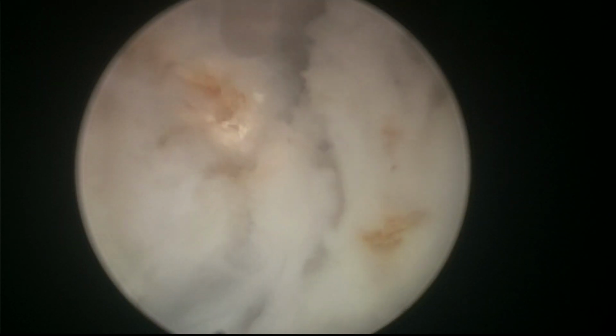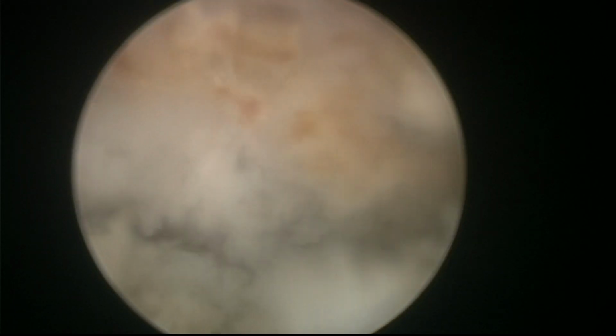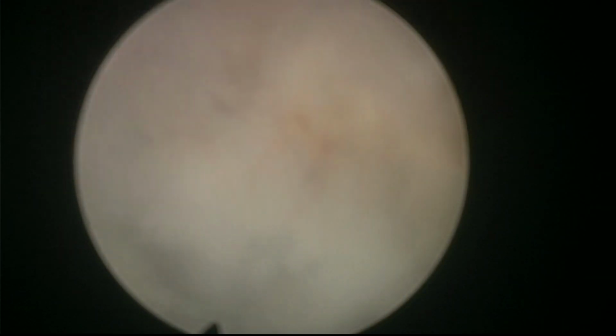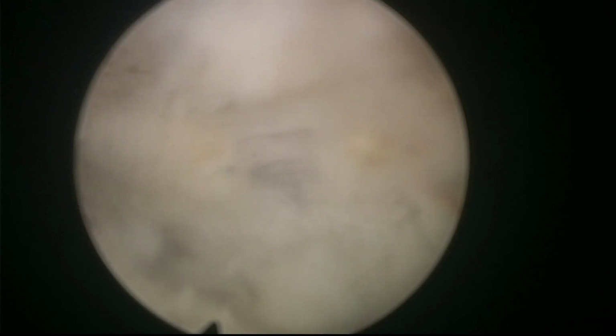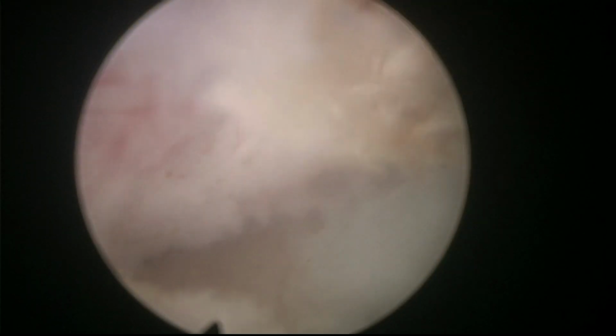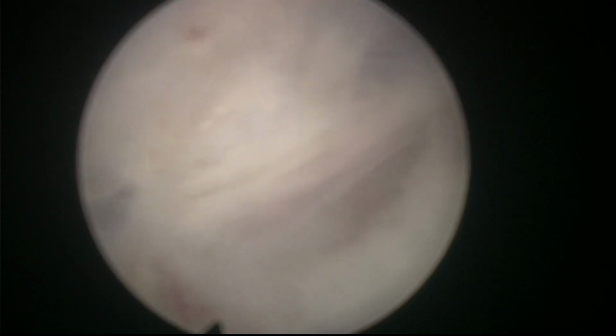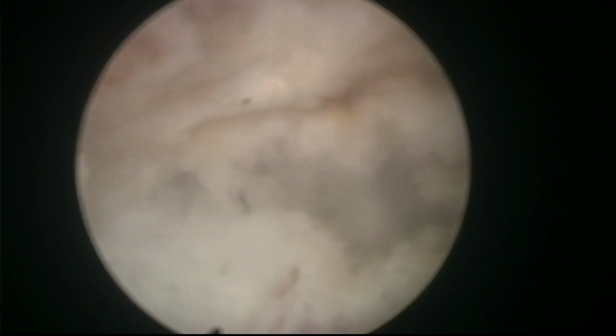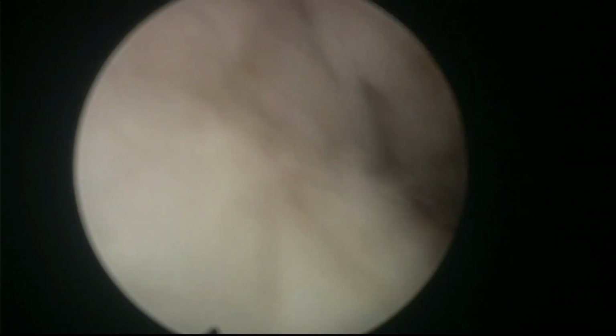if you push too hard. It's more a matter of trying to get above the adenoma, and when you lower the adenoma, everything seems to position itself properly. Here. That looks reasonable to me, you see, but we have to constantly challenge the quality of the plane if we're going all the way where we want to go.